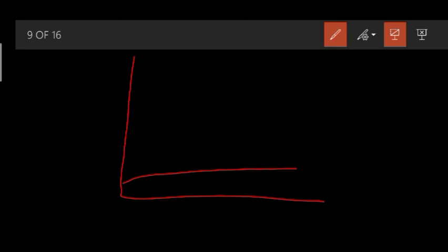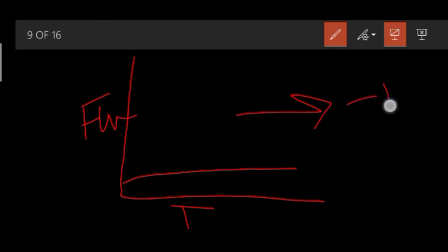If there is no change in the graph of time and fluorescence, then the person is not affected by coronavirus, and the result is negative.